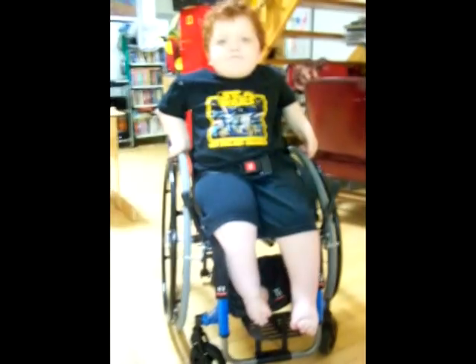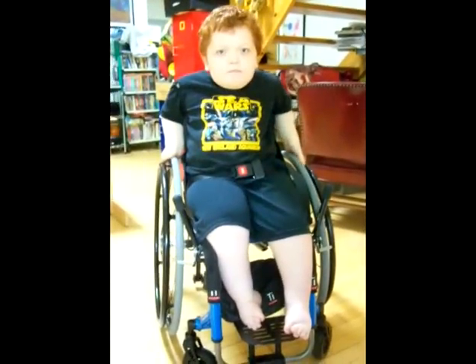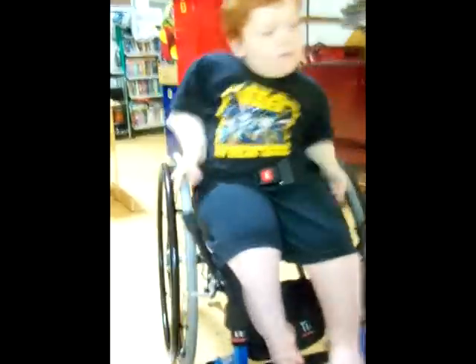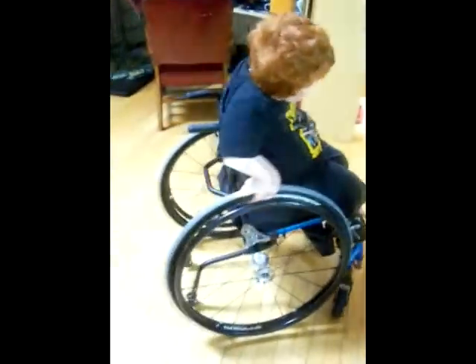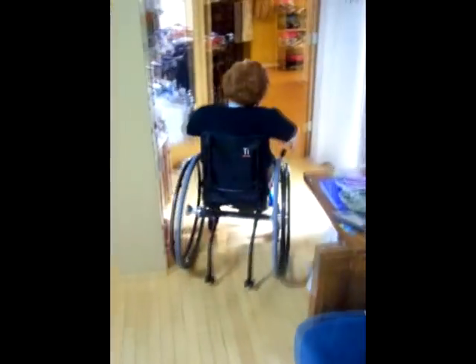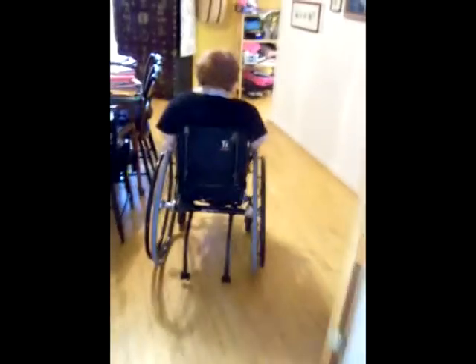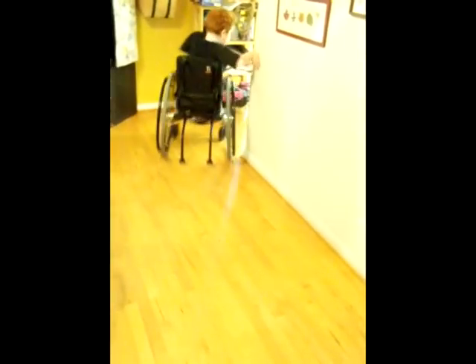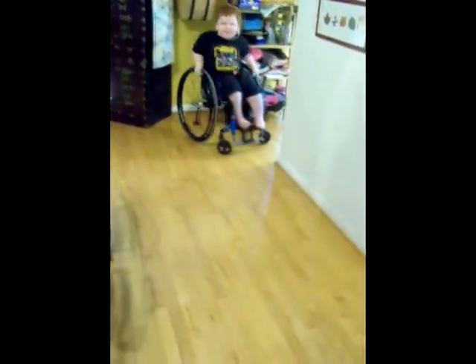Let's see you go straight — you're going to go from here straight out to the living room. Try just to use your wheelchair, not the furniture in the room to move yourself. I can do minor adjustments with my hands. Okay, stop there. I want you to stop the chair without using the walls. I cannot stop.